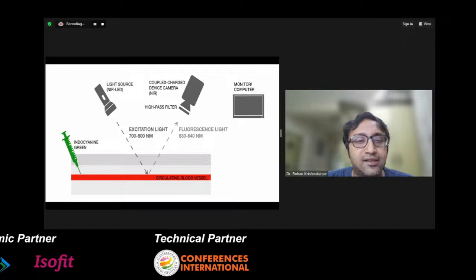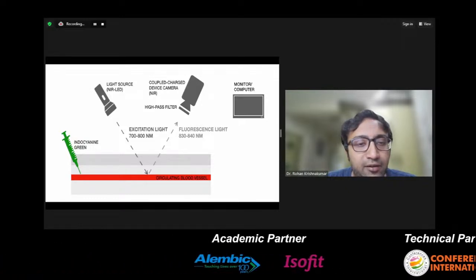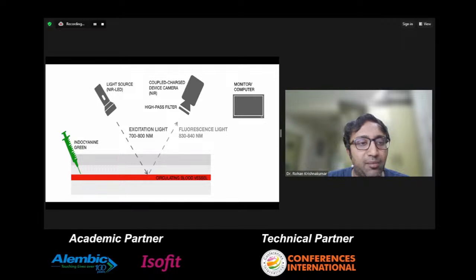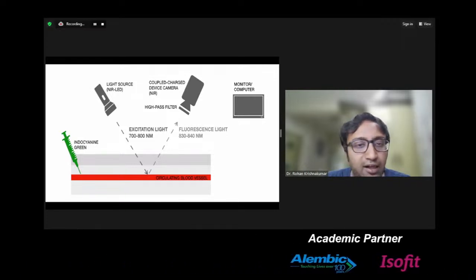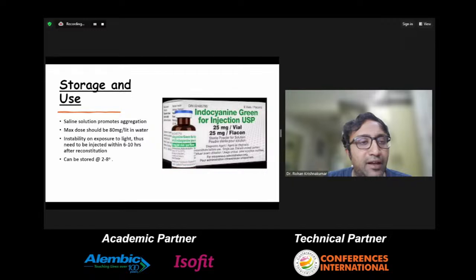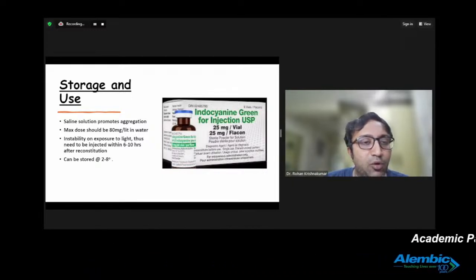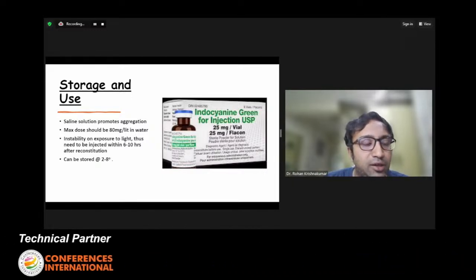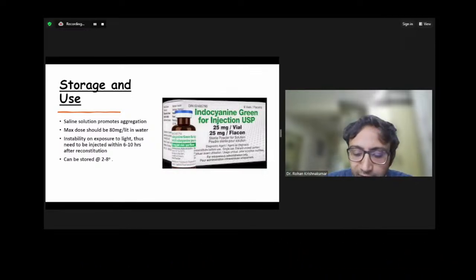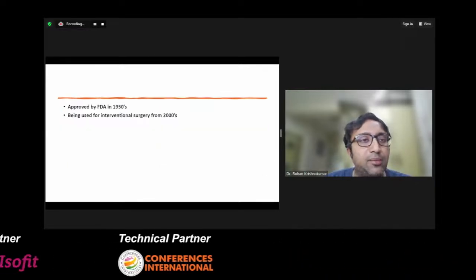We all know that it's easily excited by light between 700 to 800 nanometers, and this is used with the ICG camera by switching to near infrared imaging to see the green color of the dye. So it's very easy to store, very easy to prepare. Prepared in distilled water, it can be stored outside for 6 to 10 hours as it becomes unstable on too much exposure to light, or can be stored at 2 to 8 degrees for some time.